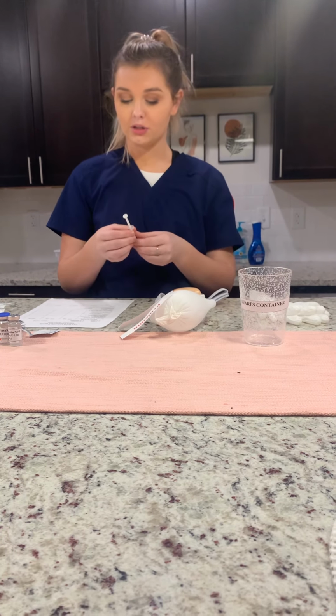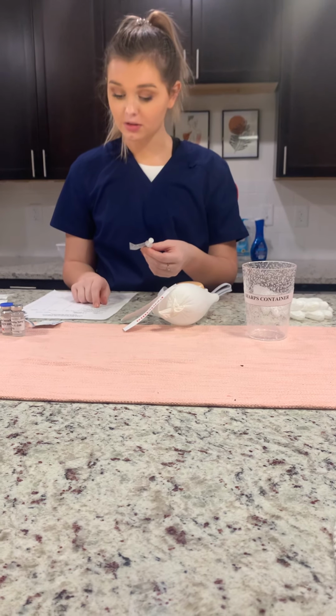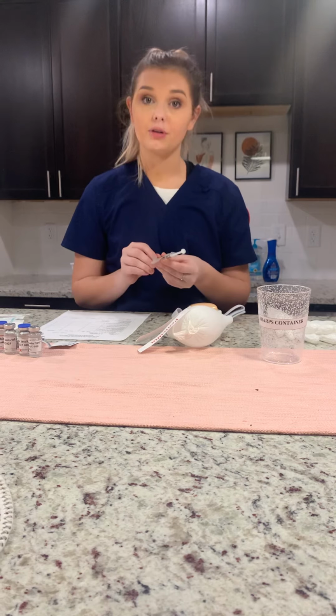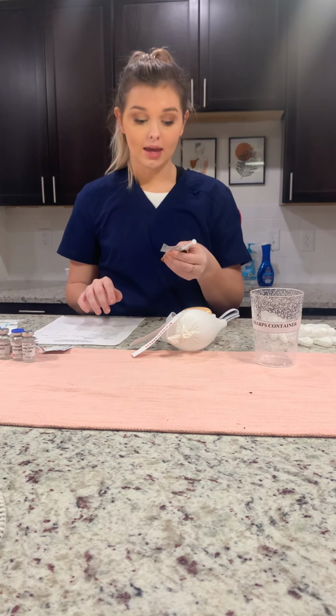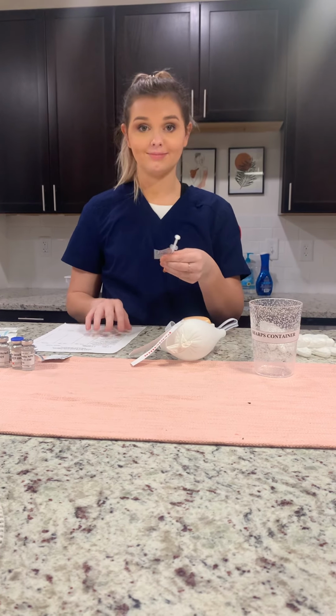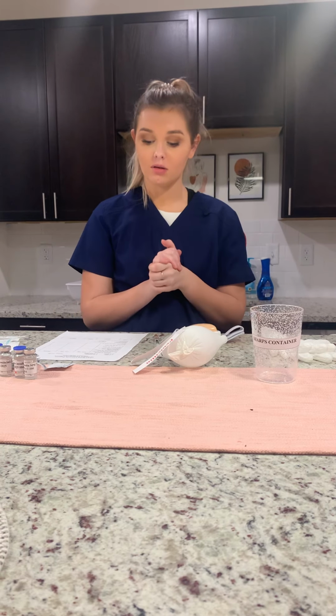And to recheck, we have heparin 5,000 units, patient Jaguar Jones. We are doing it subcutaneously, so we have the tuberculin needle, and yes. And at this time, I would perform hand hygiene.